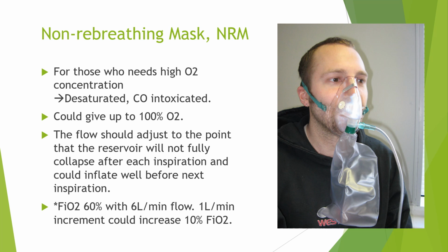What's the problem with the usage of this NRM? Remember to adjust the flow to the point that the reservoir will not collapse. In this picture, the reservoir is totally collapsed, which may cause the patient to not have enough tidal volume. So remember, the reservoir should not be fully collapsed after each inspiration and should be able to inflate well before the next inspiration.